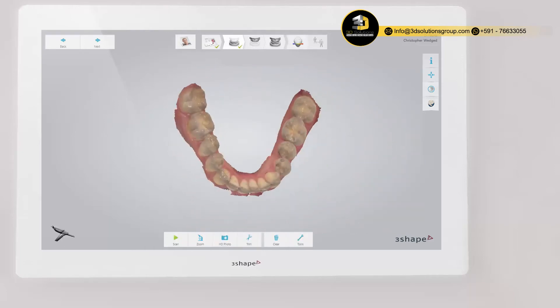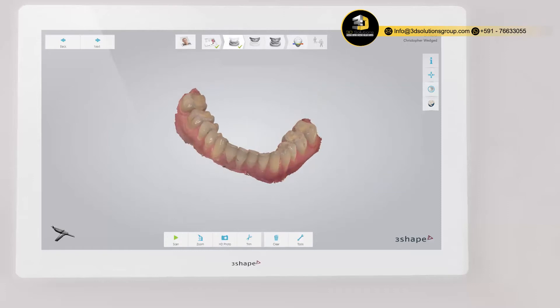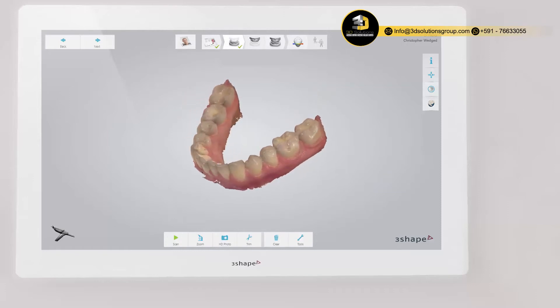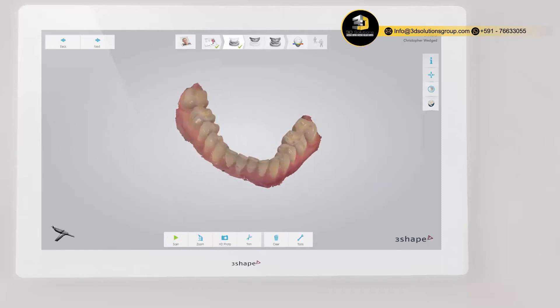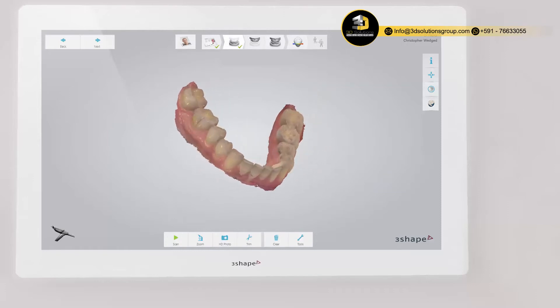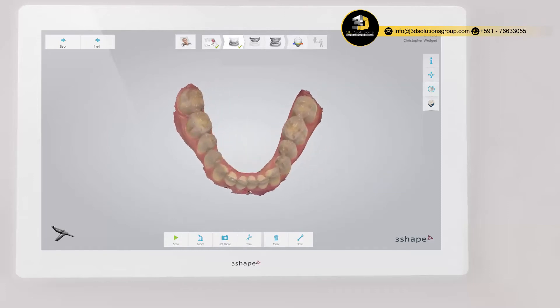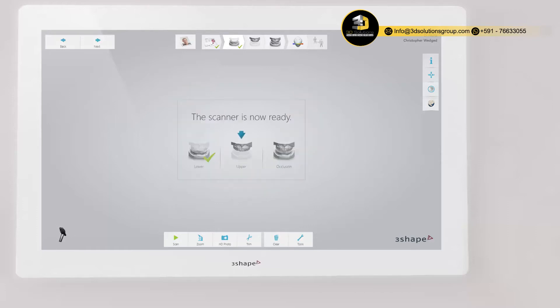Inspect the result by rotating the scan. If an important area is missing, simply start scanning the area again. When scanning is complete, you can inspect the result and prepare the scan by trimming unnecessary parts.